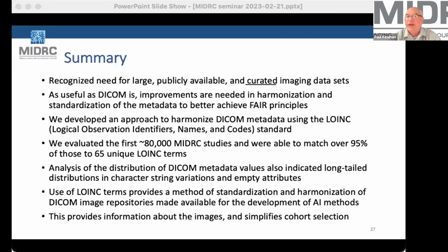The Data Explorer now provides very nice tools using the open source OHIF. OHIF is the acronym. It's a very, very useful DICOM viewer. And so we can take a quick look. We can't review every image. There are 100,000 exams, each exam containing multiple series, and some series containing hundreds of images. So it's not possible to check them all, but we do some spot checking. It does point to the need, though, for probably, literally or ironically, AI-based methods to help curate the data at some point as well.